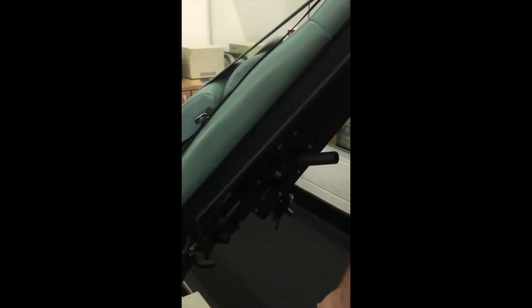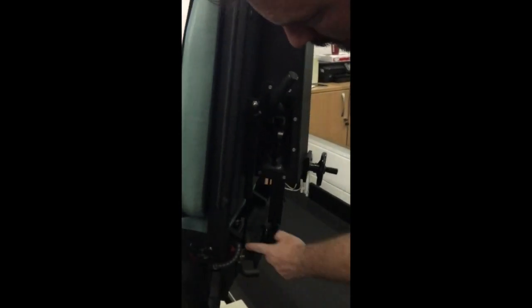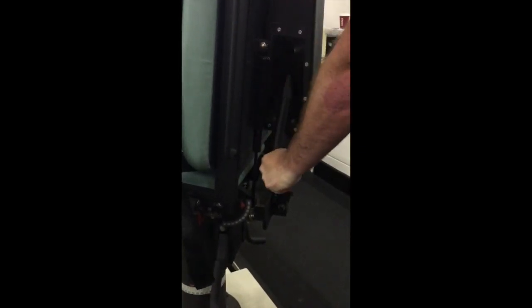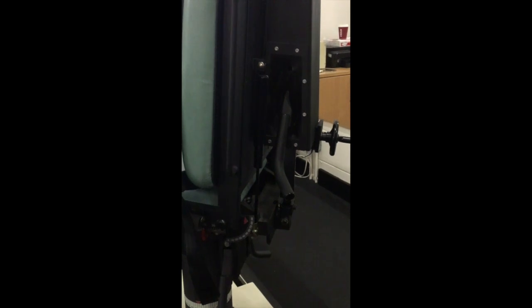Back angle, 85. So if I come around this side actually, we've got this lever here, flick it up, and then you could actually, if you want, lie the seat all the way down, set it to roughly 85, and it'll lock then, when it won't lock if you're in the wrong position.